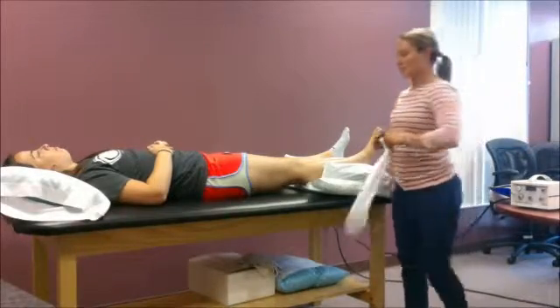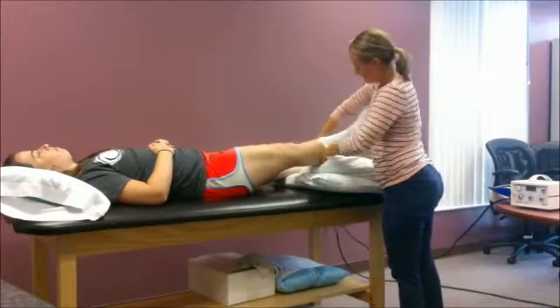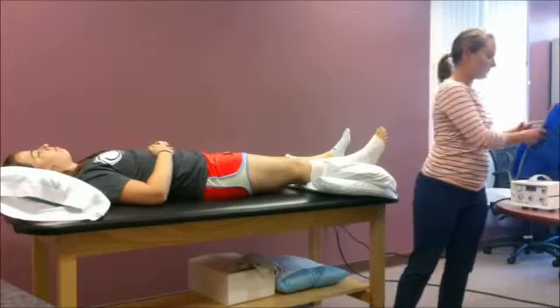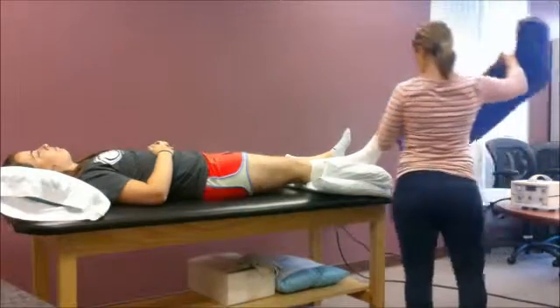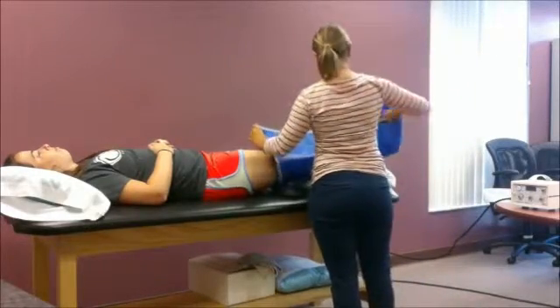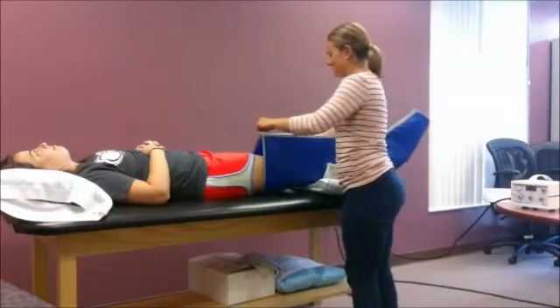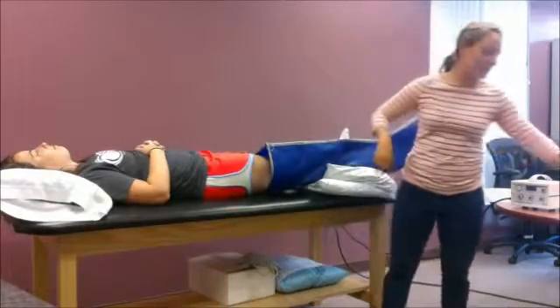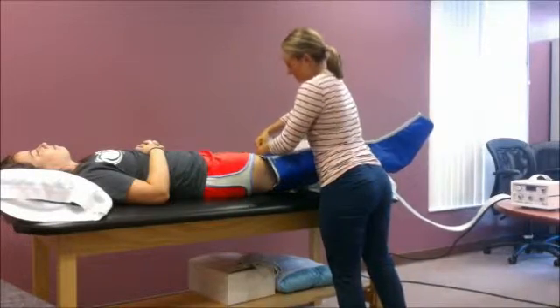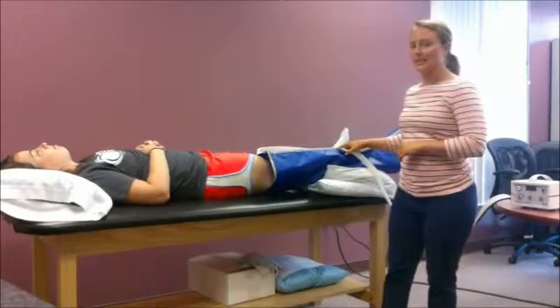So now we will get started. I'm going to apply the stocking head, then apply the compression sleeve and hook it up. I would also make sure that the patient is in a comfortable position, supine with the leg elevated on the pillow.